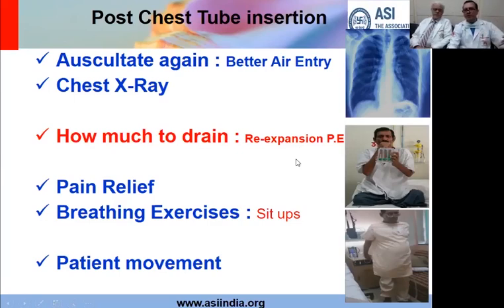So if you have a massive effusion and the lung has been collapsed for a long time, it's important that you initially drain about a liter, then clamp it for a few hours, drain another 500, 600, 800 cc after 4 to 6 hours, clamp it again, and do it in aliquots of about 500 to 700 cc at a time. And keep a watch on the hemodynamics of the patient, because sudden drainage of a large amount of fluid, especially in a hypovolemic patient, can actually lead to hypotension also.